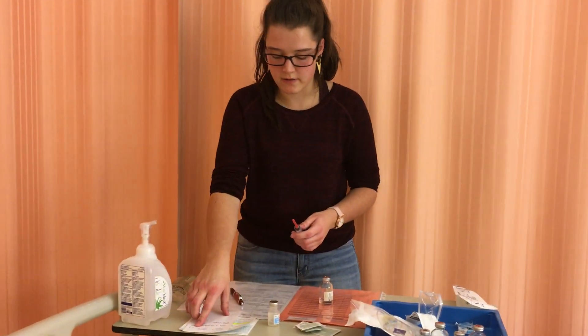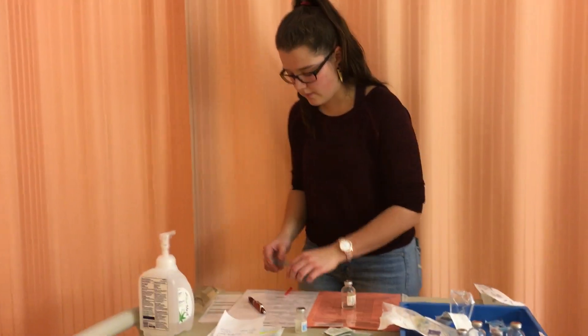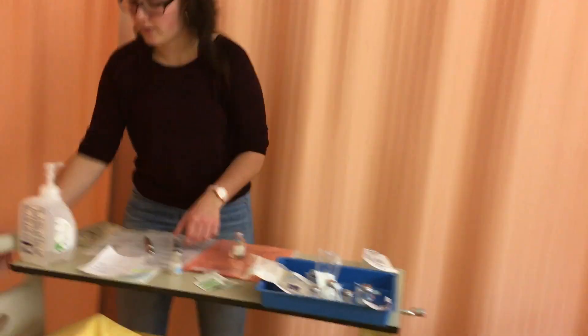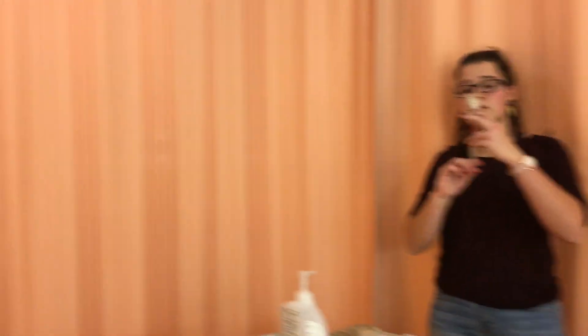I've calculated that I need 4 milliliters of the drug. I'll get 4 milliliters of air first. Actually, I'm going to clean the vial just in case I contaminated it — clean for 30 seconds and let it dry for 15. Now I'll install 4 milliliters of air and pull out 4 milliliters of drug. I have no bubbles and exactly 4 milliliters.